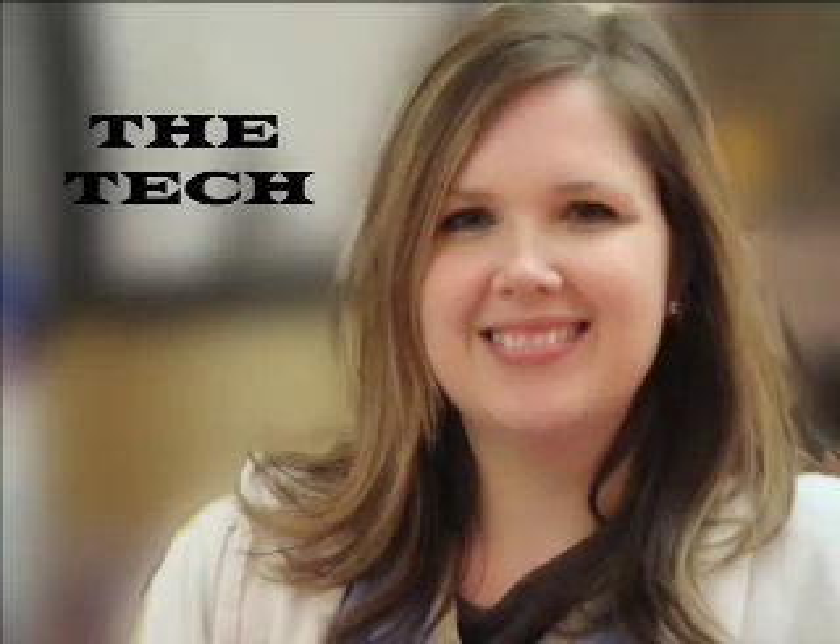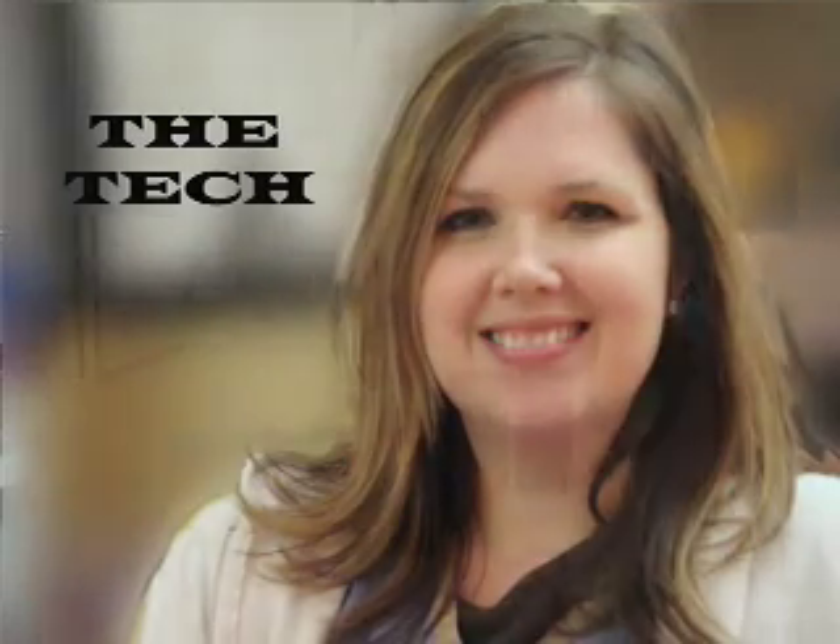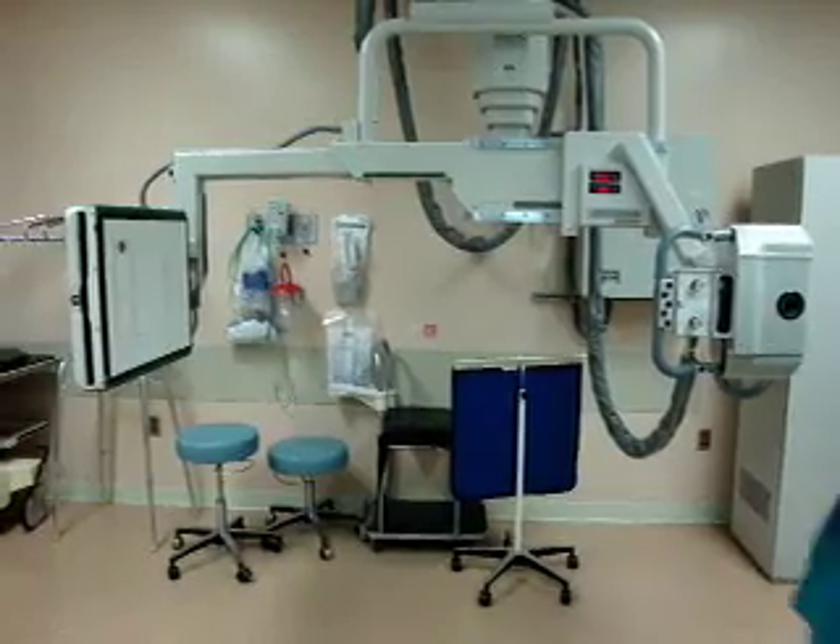My name is Laura and I'm an x-ray tech at Lutheran Hospital, and today we will be explaining how a chest x-ray is done.